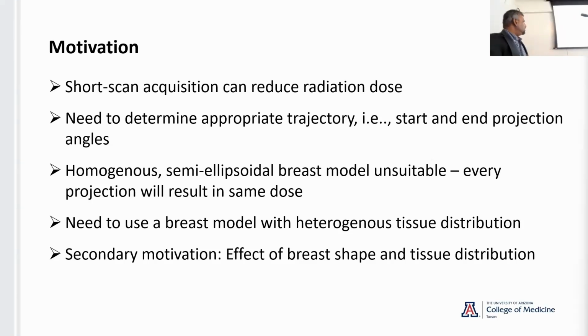won't get... So we have to actually look at the clinical data for patients to see what's the real tissue distribution in patients. And so the second is to look at how the shape change between patients varies the dose distribution.